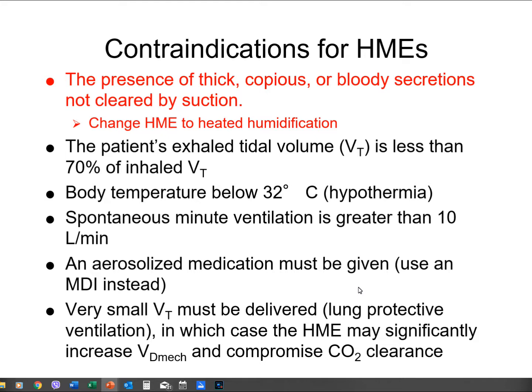On contraindications for HMEs, let me take a step back. HMEs are used as a temporary means. Some places they use them for permanent, and you change them Q12 or if they're just really, really caked and dirty, that's when you would change your HME. But it's supposed to be used for short trips. Like if I'm going to take a patient in subacute to the showers and back, if I'm going to transport a patient from their room to activities, or if I'm going to take a trach patient that came into my ER to CT, I'll pop in an HME.